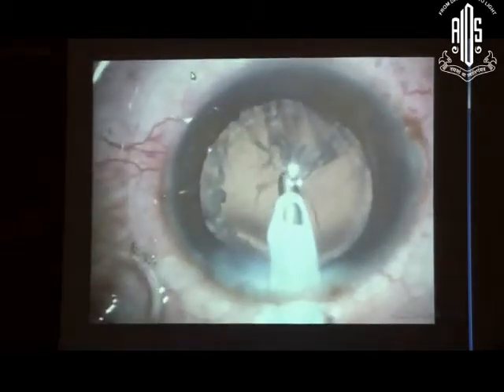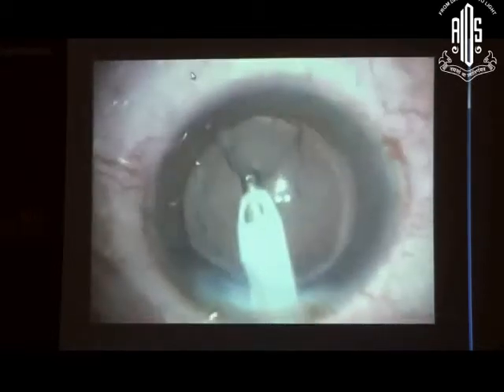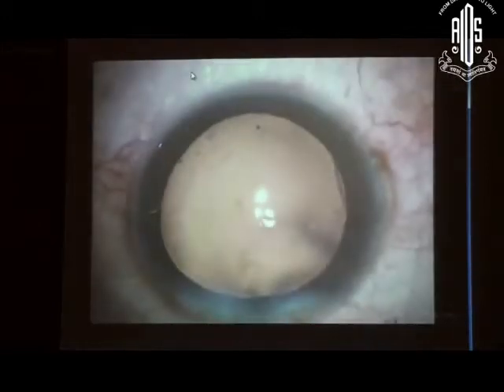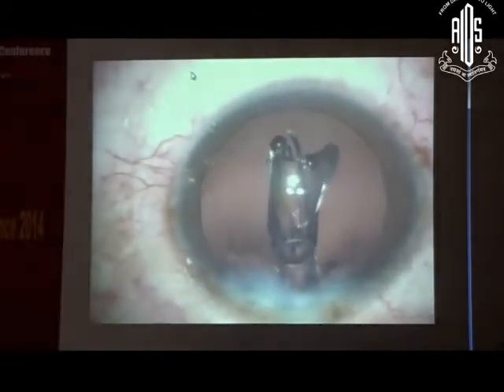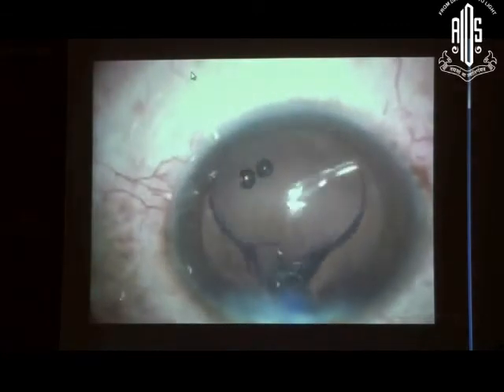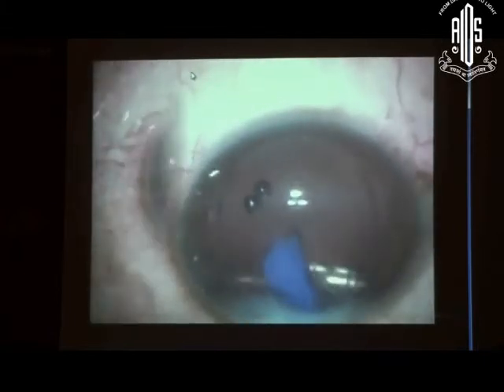So we're coming to the end of the time, and in fact this is almost my last video anyway. There is another one I did in a child. I did an anterior capsulotomy and also a posterior capsulotomy of 3 millimeters. And that is another feature that's going to happen. Unfortunately, my guys forgot to include the video in here. Believe me, that is another futuristic thing.